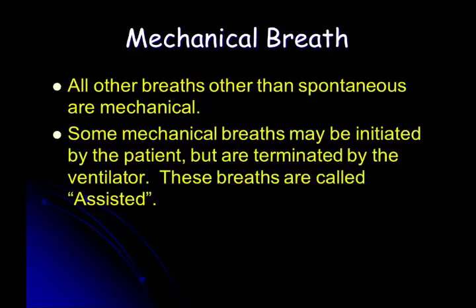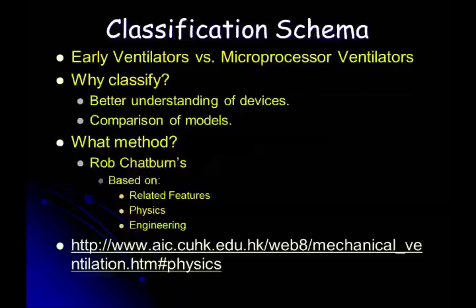Those mandatory or mechanical breaths can be started by the patient. In other words, the patient tells the ventilator, "Hey, buddy, give me a breath." Or, in the face of apnea, the ventilator can just fire on its own. Okay? So there needs to be some way that we can all be on the same page with this.